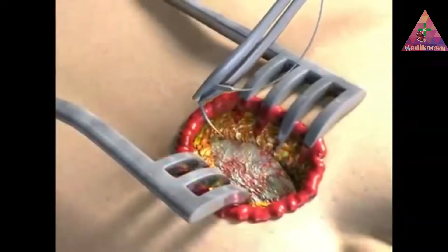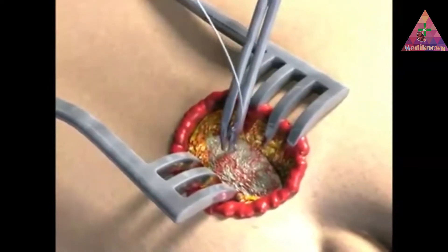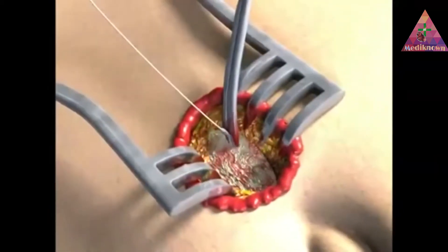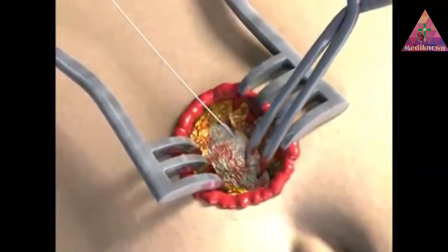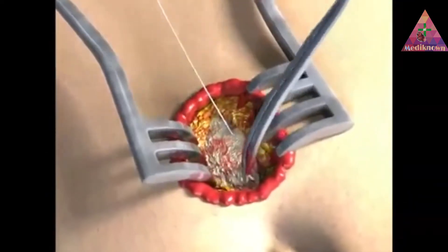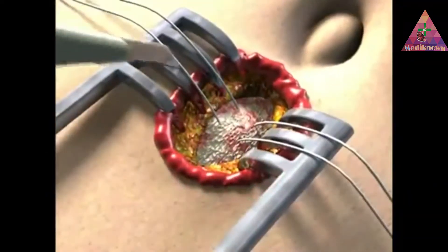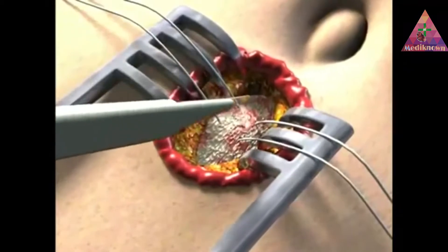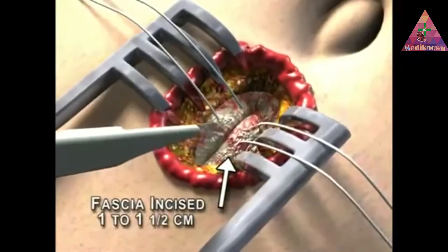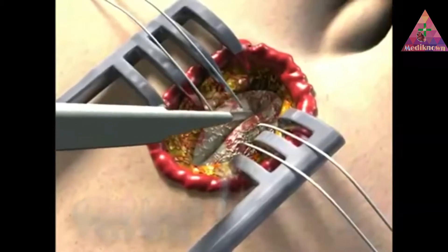Stay sutures of 2-0 Vicryl are placed in the fascia on both sides of the incision. The fascia is then incised for 1 to 1.5 centimeters, again vertically.